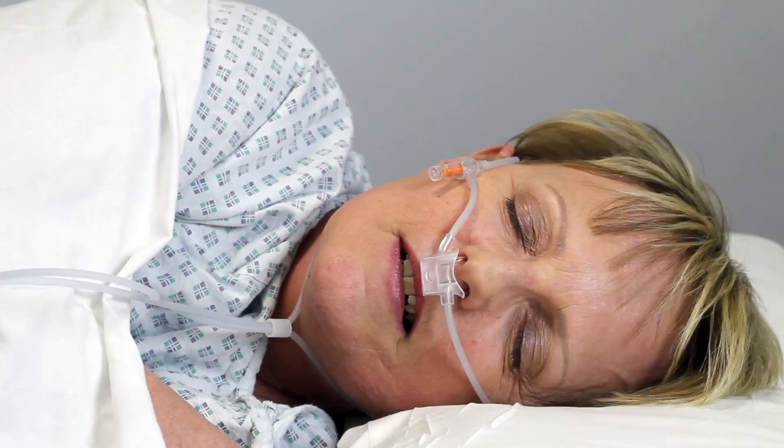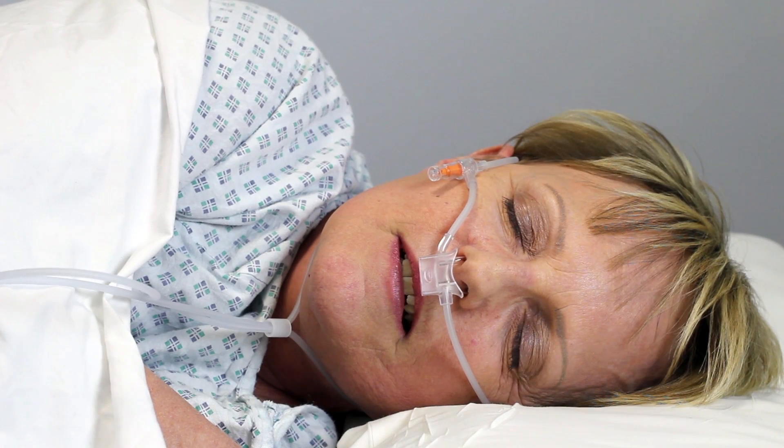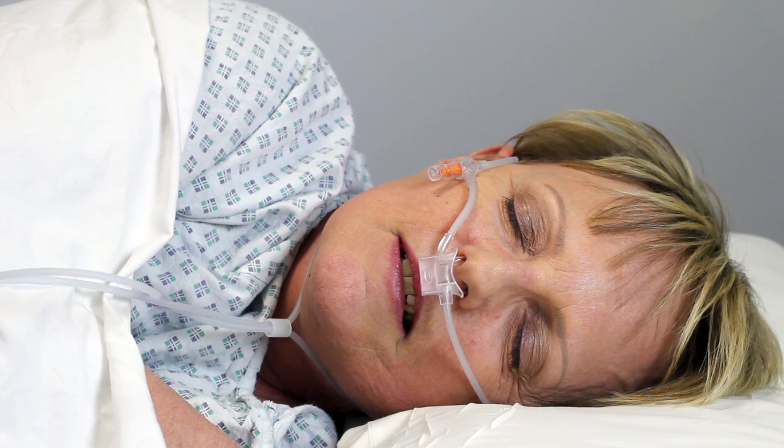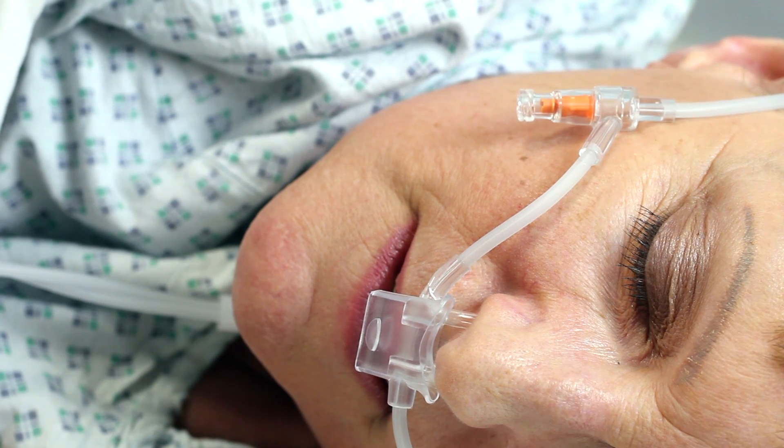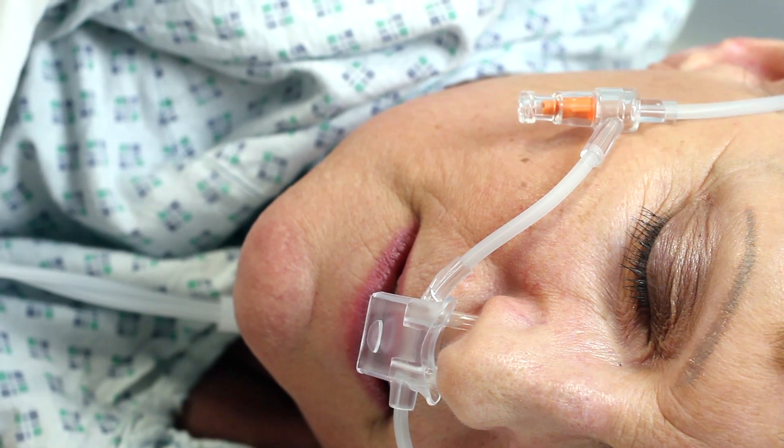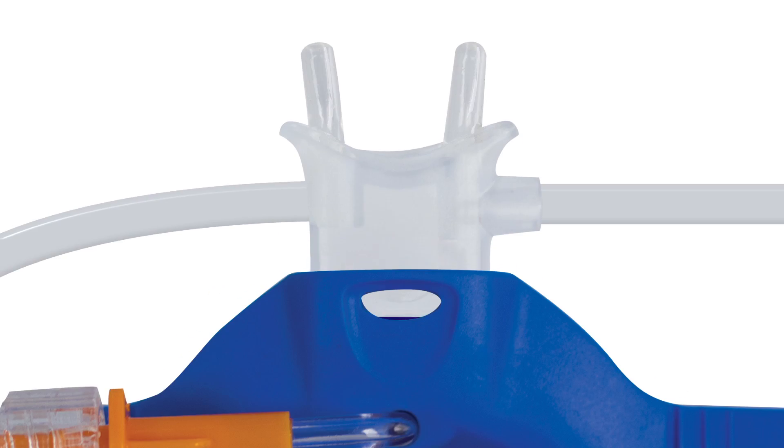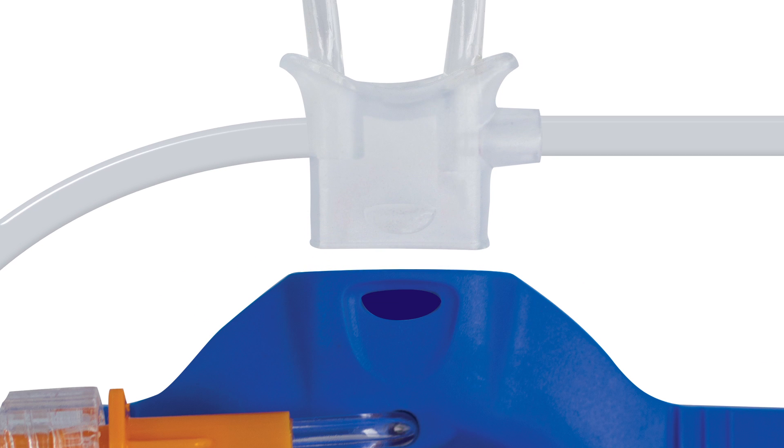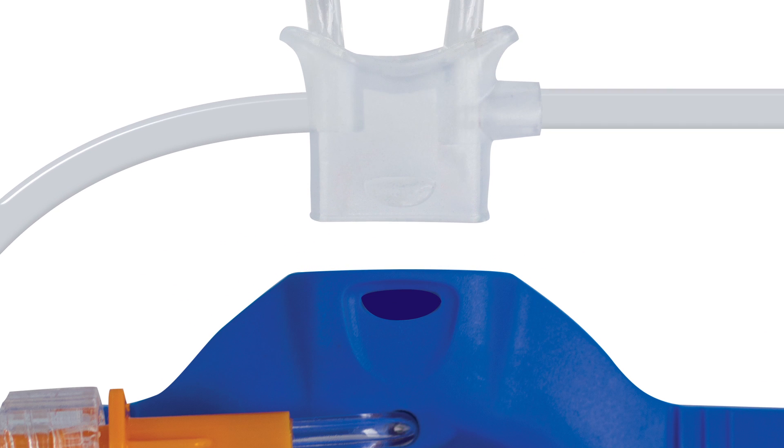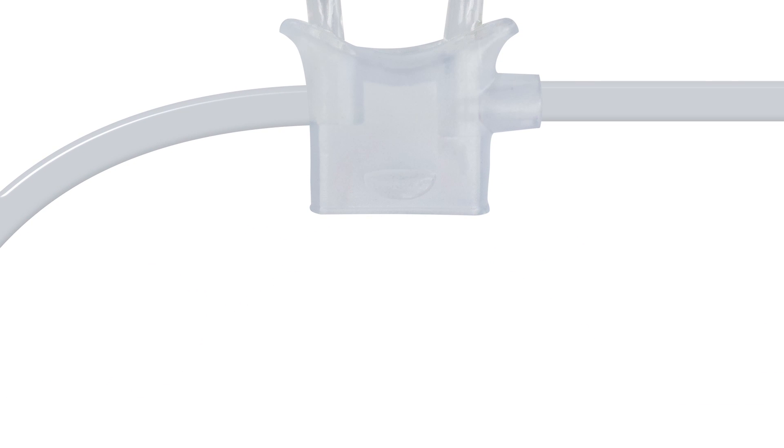The nasal cannula delivers a continuous supply of oxygen and monitors end tidal CO2 without the need for additional products. With a detachable nasal piece, this all-in-one product provides everything needed from pre-procedure through to recovery.